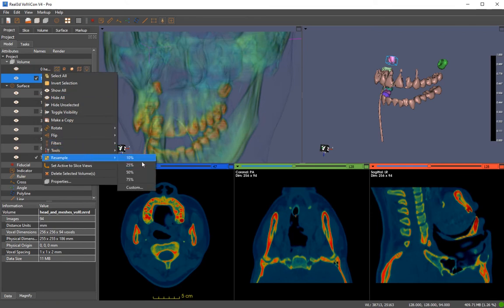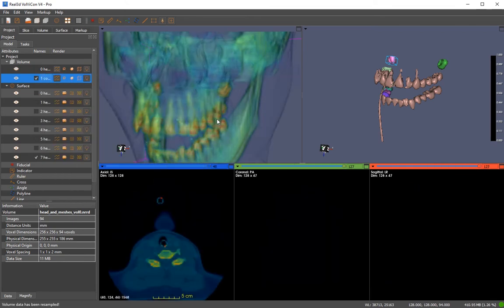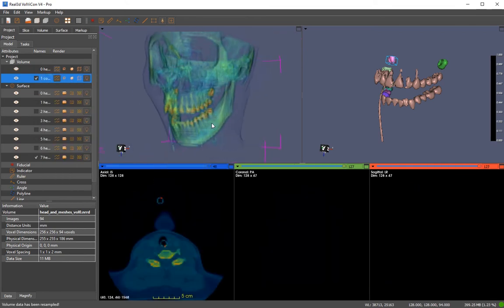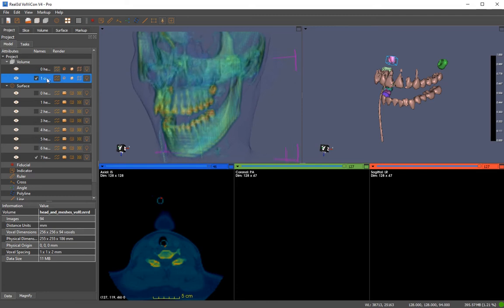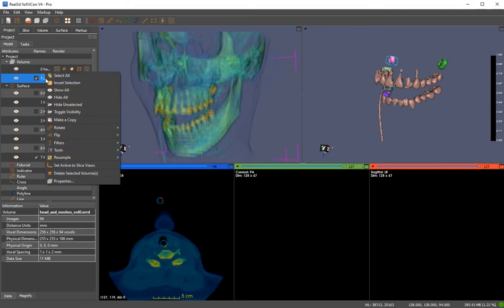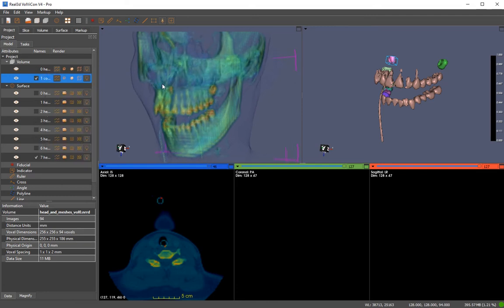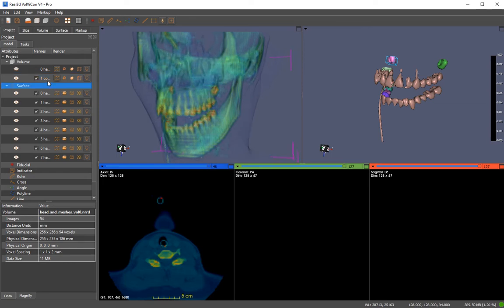You can perform resampling. Let me create a copy and resample it to 50% — the data is resampled and you can see the data size and memory usage. This is helpful if you have really large data; for example, I imported a 45 gigabyte dataset, resampled it to 50%, and ended up with only about 22.5 gigabytes of data. Let me delete this resampled data.